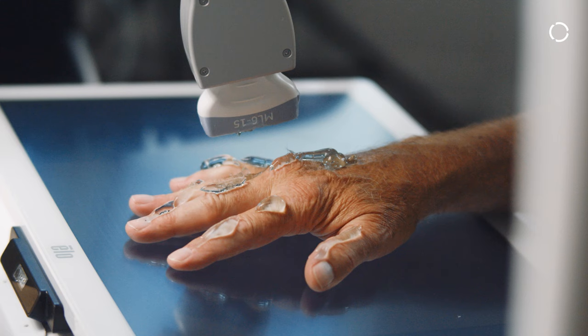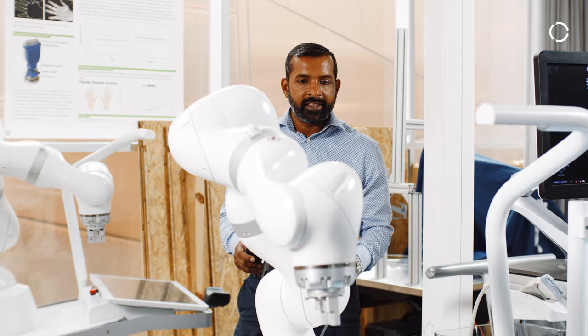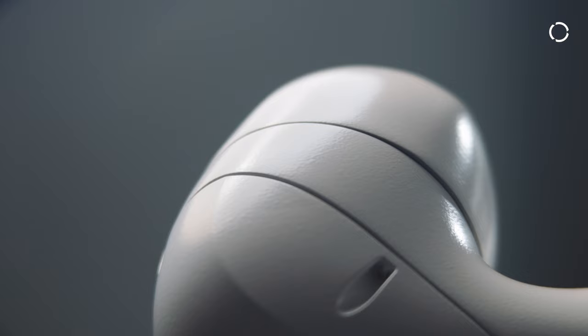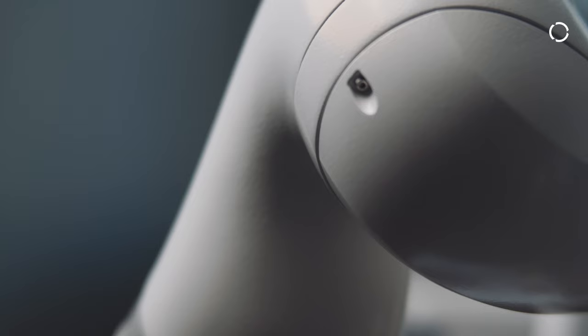The LBR Med comes with force control and can do soft landing. All the safety algorithms are built into the controller itself. It has a seven-degree-of-freedom robotic arm, which is an advantage when you have close interaction with patients. You don't want the robot to make a lot of transitional movements. So all in all, the KUKA LBR Med is a very good choice for creating medical products.